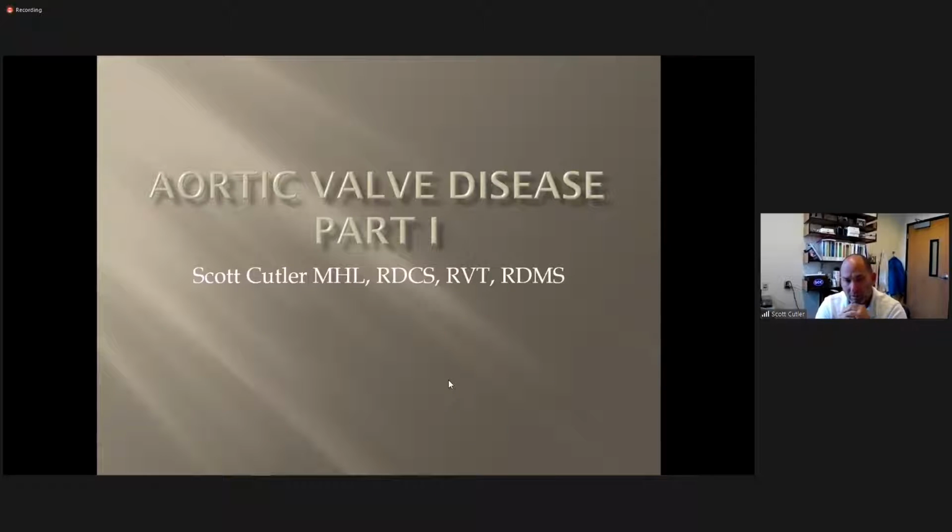And then when I stick my pulse wave and my spectral Doppler on, I'm now quantifying via the flow Dopplers how much flow, how fast the flow is, those kinds of things, and comparing those to the normal tables and charts and the severities, so we can grade exactly how severe that is. So that they can make the next clinical decision to either go to another test or to do surgery or whatever needs to be done.